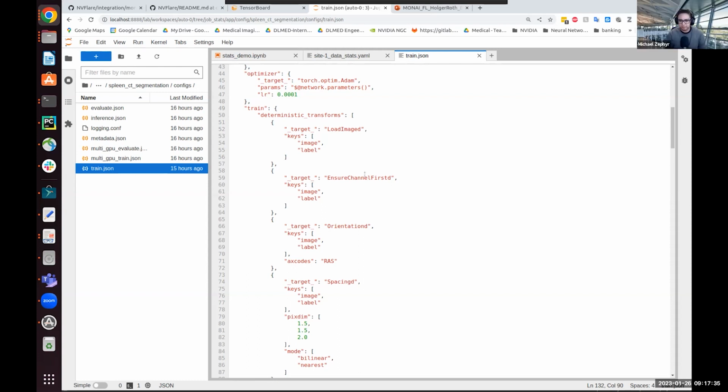All right, next question. And this is broader. I think this isn't really related necessarily to federated learning, so anyone can chime in here. They're asking, are there any tools to interactively visualize the 3D segmentations? And if it's GPU accelerated, the better. They mentioned that they already use ImageJ. Some people in chat mentioned Slicer, ITK-SNAP, ParaView.